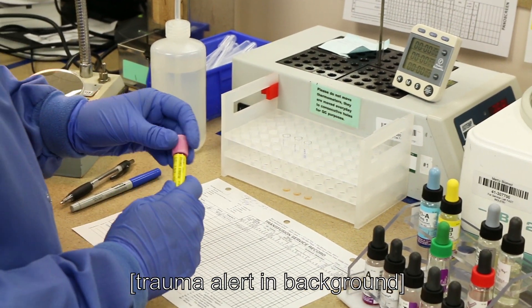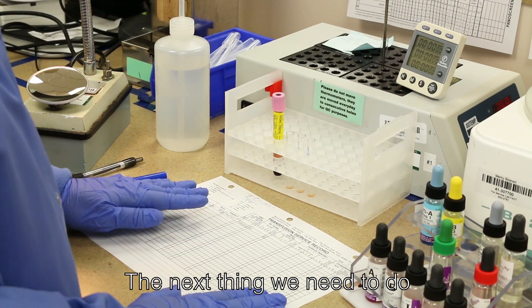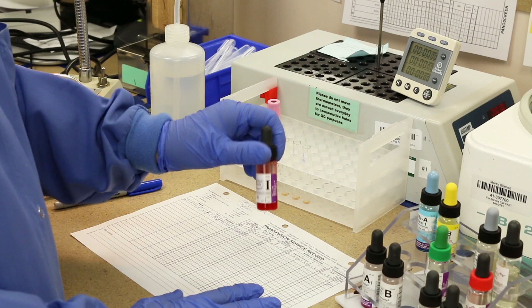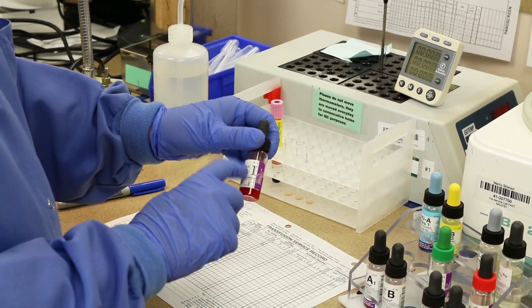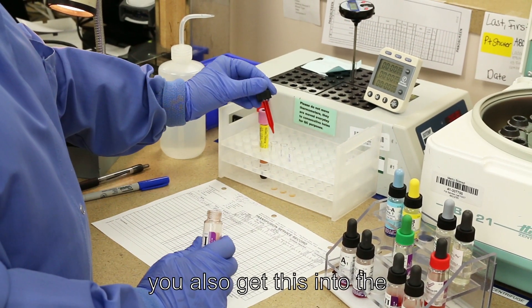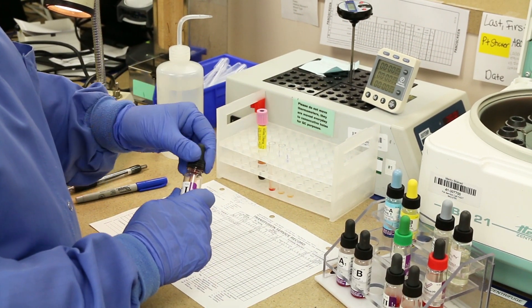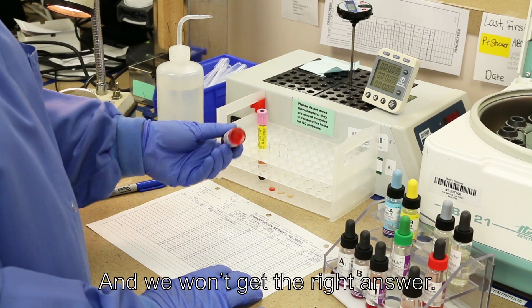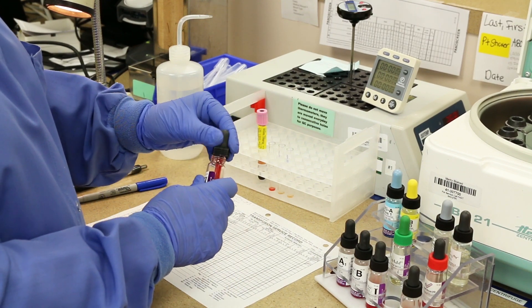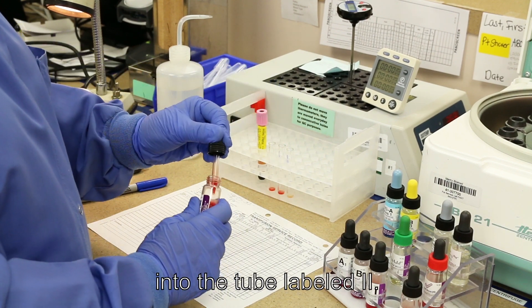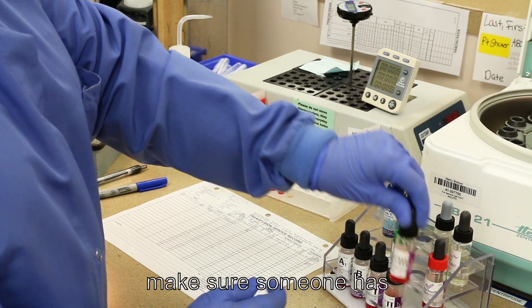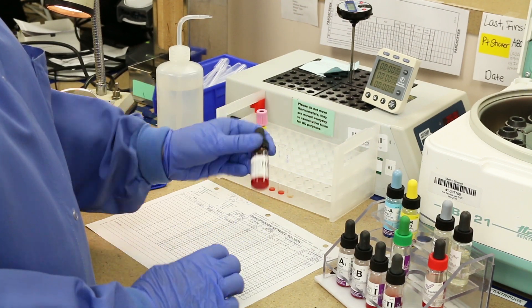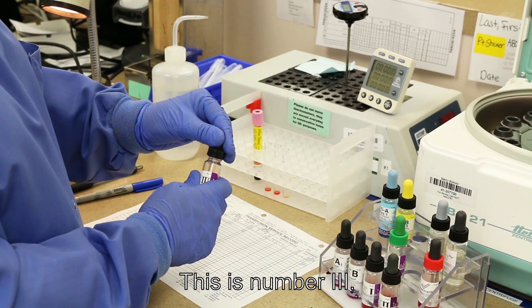The next thing we need to do is add the reagents to our 1, 2, and 3. These are cells again, so we need to make sure that they are thoroughly mixed. This is Roman numeral 1. You want to make sure that you get this into the tube that you also labeled 1. If you happen to get these mixed up, it's like messing up the answer key to a puzzle, and we won't get the right answer. This is 2, and it's going into the tube labeled 2. The other thing is to make sure that someone has screwed the cap on prior to you, because if this is unscrewed and you go to mix it, you're going to have reagents everywhere. This is number 3, so I'm adding this.